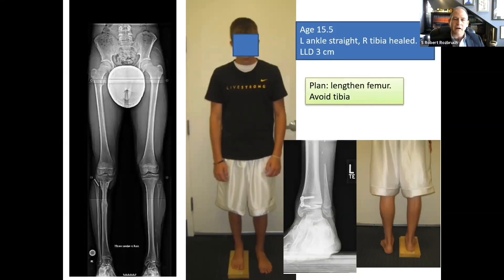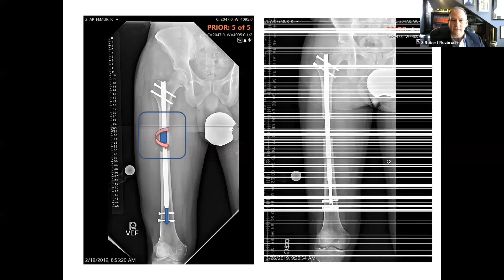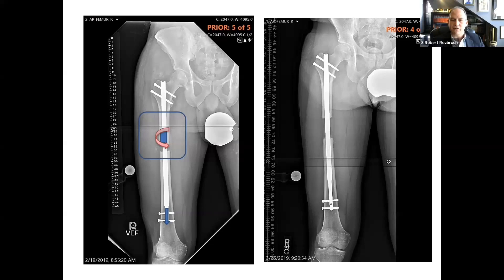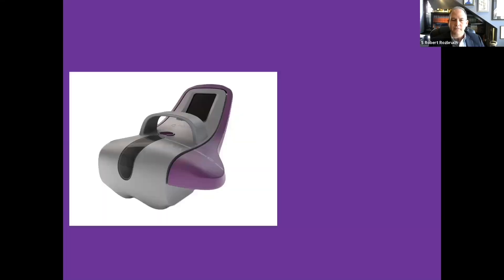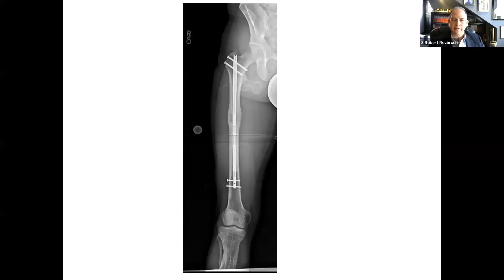The approach was to avoid the tibia and lengthen the femur using an internal lengthening rod — a motorized internal nail with a magnet that sits inside the nail. A remote control device applied to the surface of the skin spins the magnet and gradually elongates the nail. This is what it looks like as the distraction progresses, and here it is after healing of a 3-centimeter lengthening.